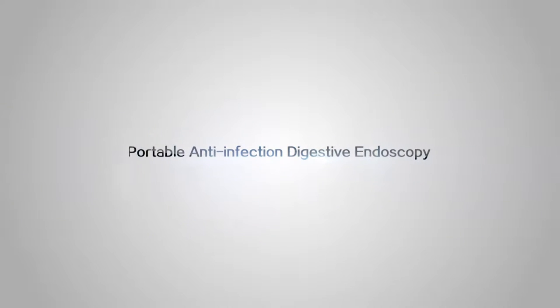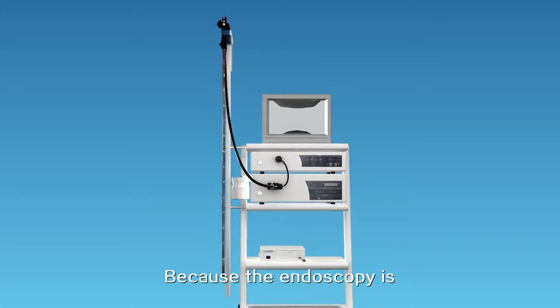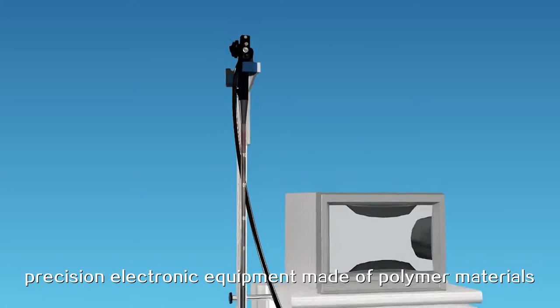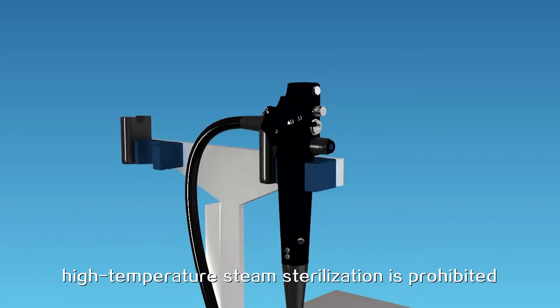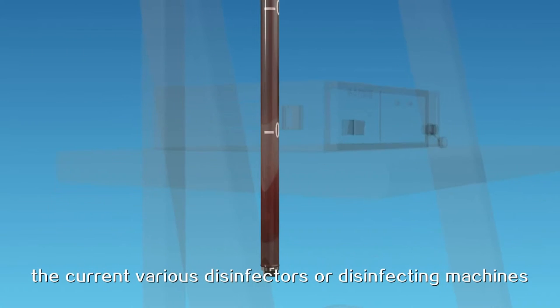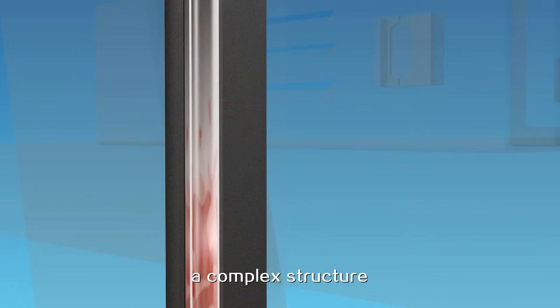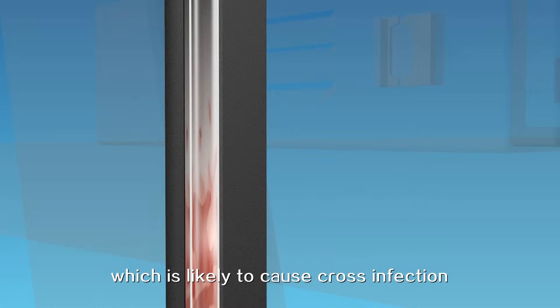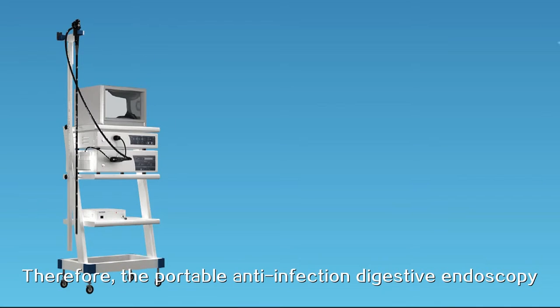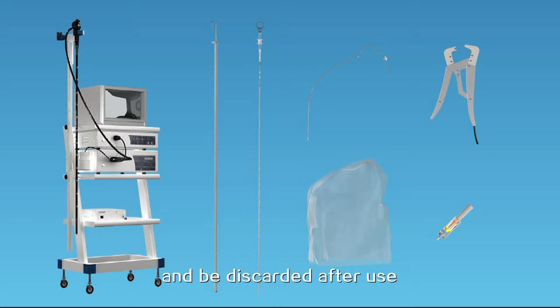Portable anti-infection digestive endoscopy: research background. Because endoscopy is precision electronic equipment made of polymer materials, high-temperature steam sterilization is prohibited. However, current disinfectors or disinfecting machines are hard to completely disinfect the lens body with its complex structure, which is likely to cause cross infection. Therefore, the portable anti-infection digestive endoscopy is designed with disposable consumptive material which will separate the lens and patient cavity and be discarded after use.